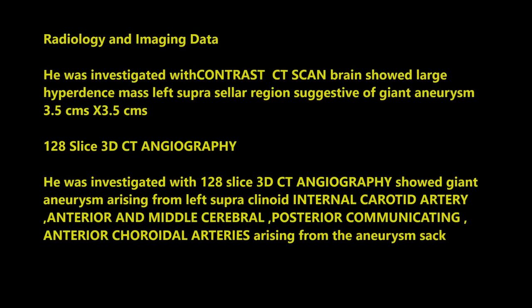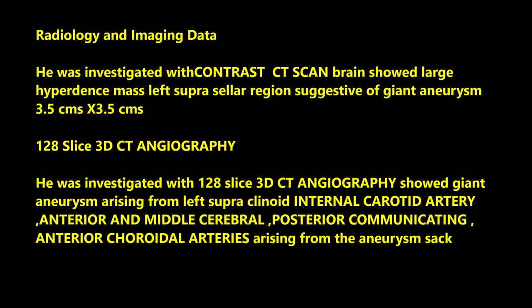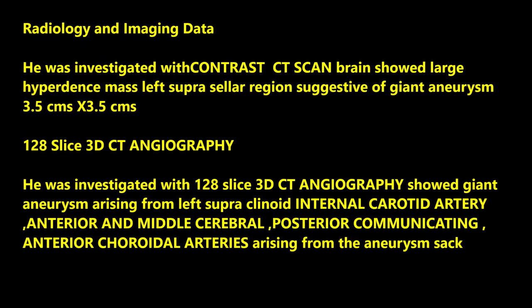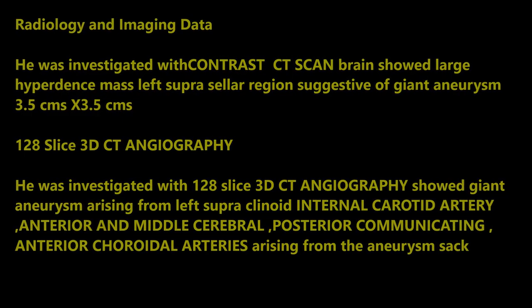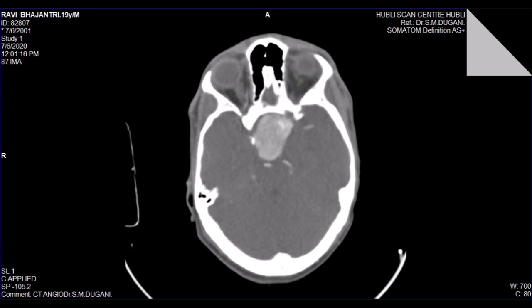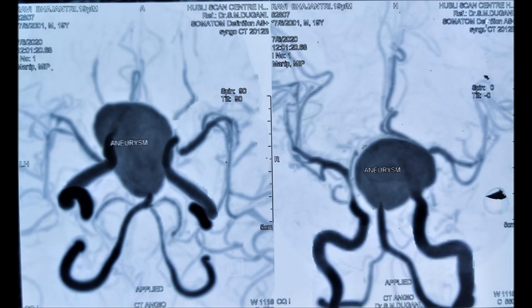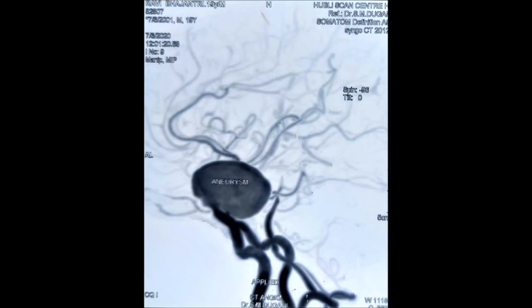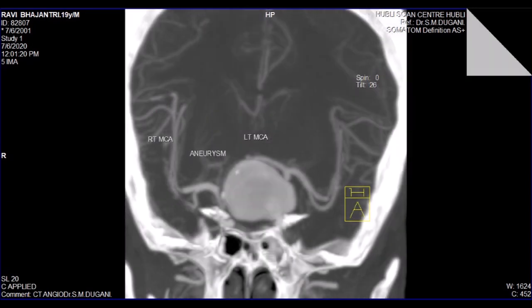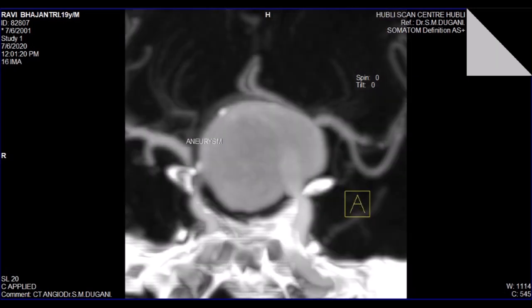He was investigated with a CT scan brain plain and contrast outside, which showed a large suprasellar mass enhancing with contrast, suggestive of a giant intracranial aneurysm with a size of 3.5 cm by 3.5 cm. Subsequently, he was investigated with 128-slice 3D CT angiography, which showed a giant aneurysm in the suprasellar region on the left side, originating from the left internal carotid artery, supra-clinoid part.